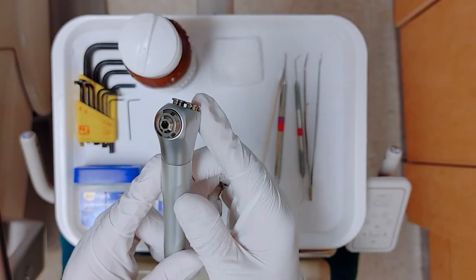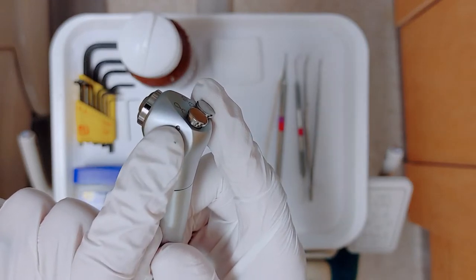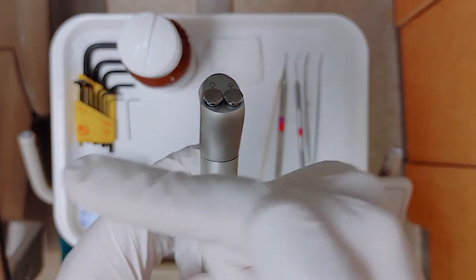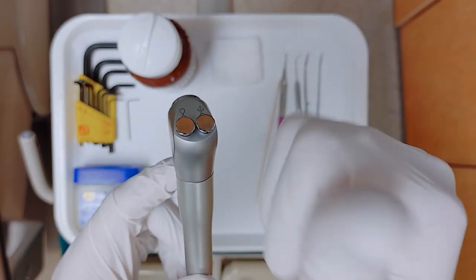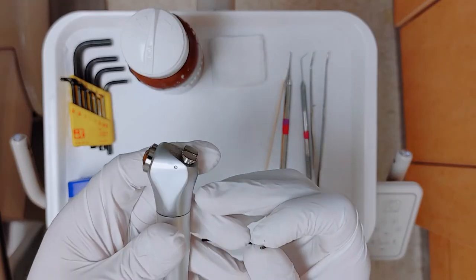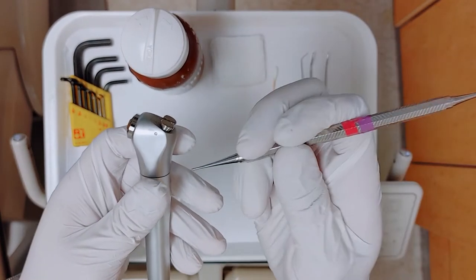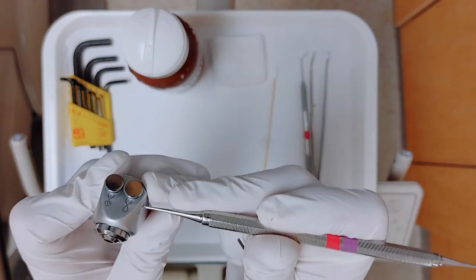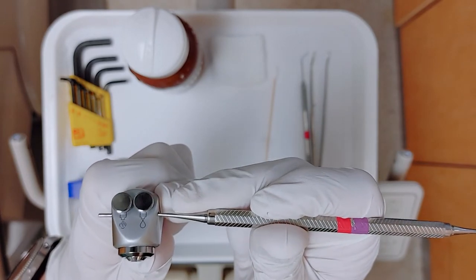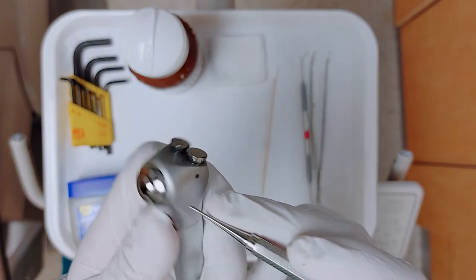When it comes to cleaning out a button on this style type of air water syringe, first thing to look at is this retention key that's right here off on the side. What we're going to need to do is push this retention key all the way through one side out the other so that we can get these buttons out, because right now that retention key locks those in place. A way that you can work on this is taking your smallest Allen key, or maybe even a broken instrument that might fit this hole, and you're going to push this retention pin out the side. Now you can't just push it completely in and get it all the way out, because these buttons are also held in by another spring.